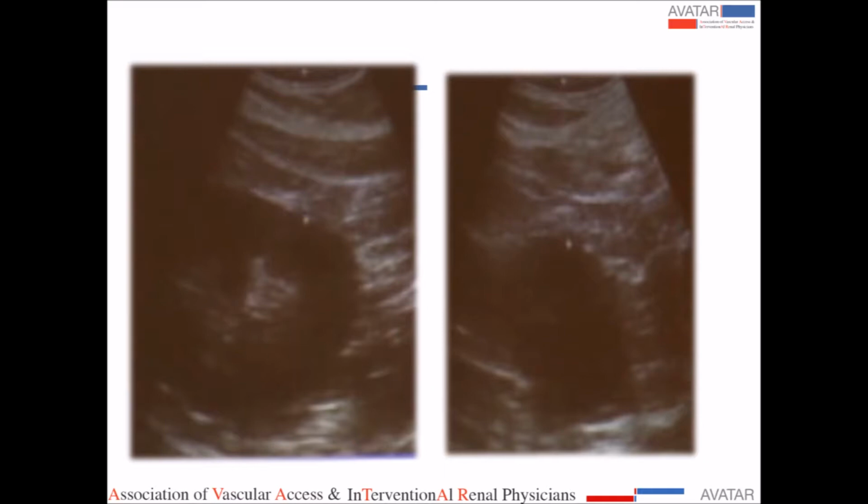Now, you can do the ultrasound 2 ways. You can do it absolutely real time, with a sterile probe over it. We use the ultrasound more as a guide than as a real-time ultrasound.